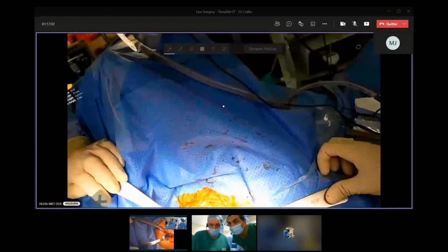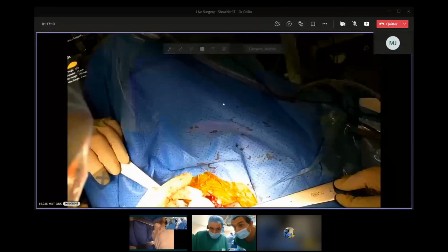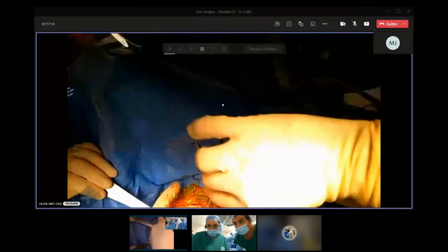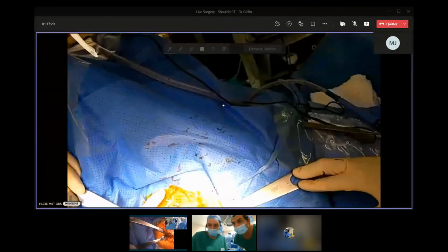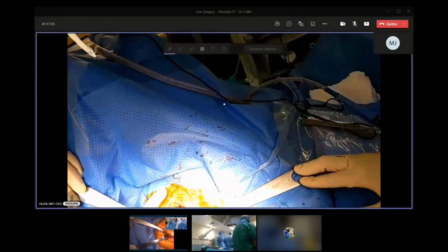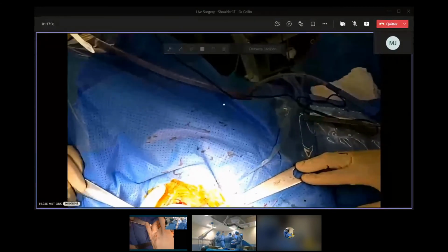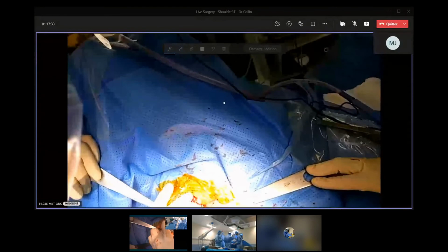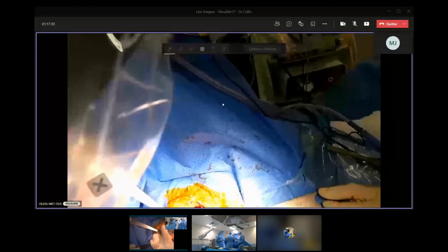Le plateau. So this is the tray. You can see it. So it's a low eccentricity, and we are going to put it in this position. Like this, I'm going to distalize a bit. So in order to answer the question of Philippe, when you put your tray like this, it's not like an eccentric sphere, but you distalize a bit more the humerus. If you put it the other way, with this higher, then you lateralize more. What do you want to do for this patient? I think it's probably a bit useful to distalize a bit. It's always better.